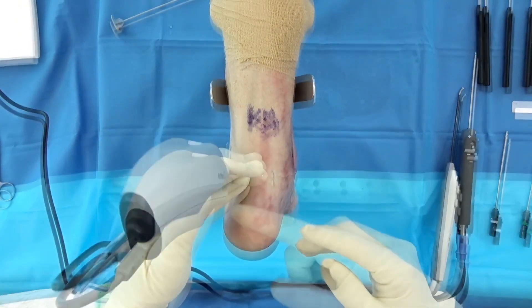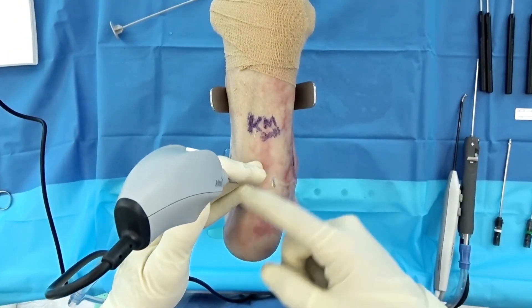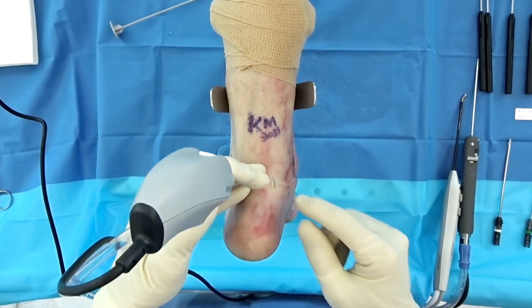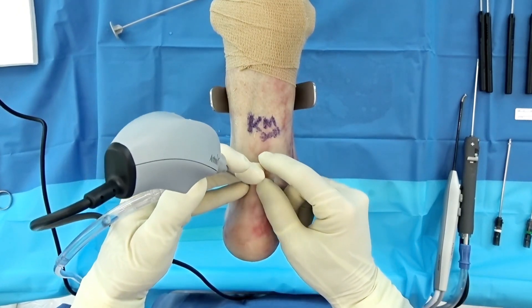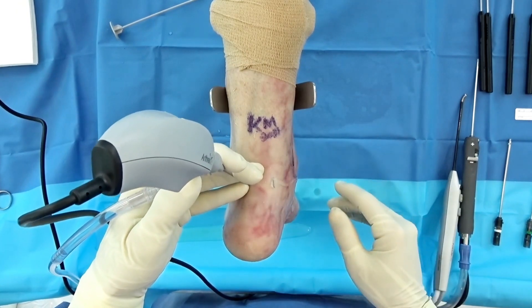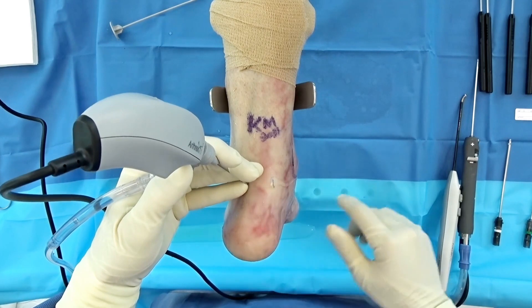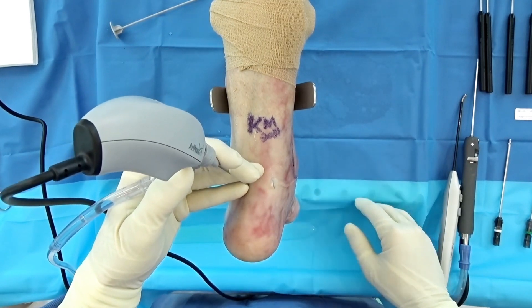One thing I'll tell you: if you look at my hand right here, as I rest my pinky or some of my hand on the tissue, that allows you to have good proprioception. Because the Nano is so small and so slick, you'll find yourself pistoning in and out of the joint and really obscuring your own view. So this is a great little tip — rest something on there, it really allows you to have good control.